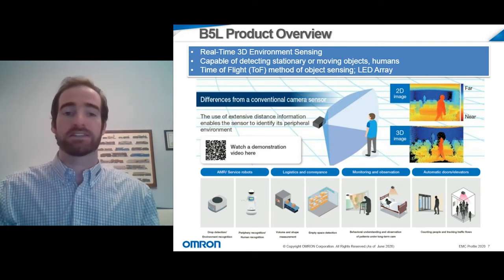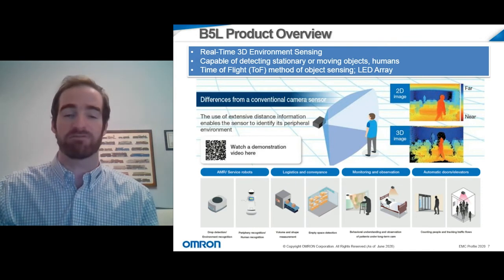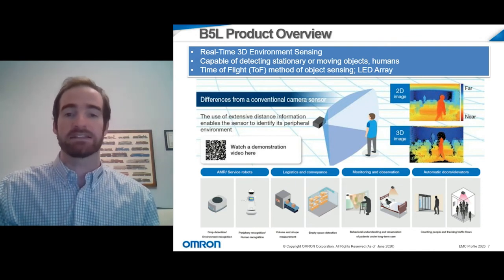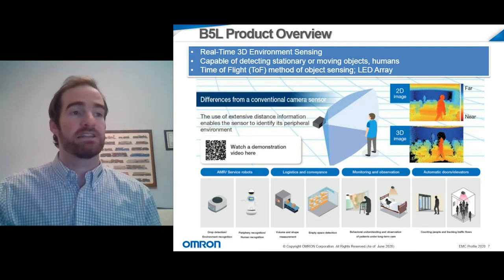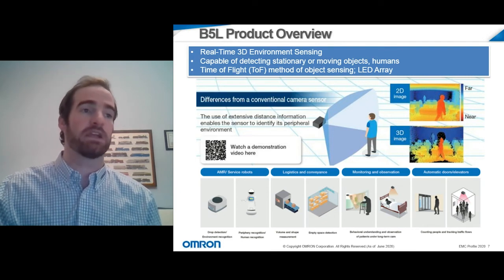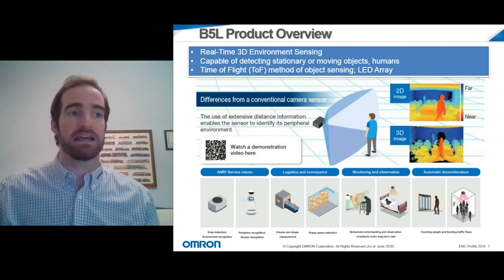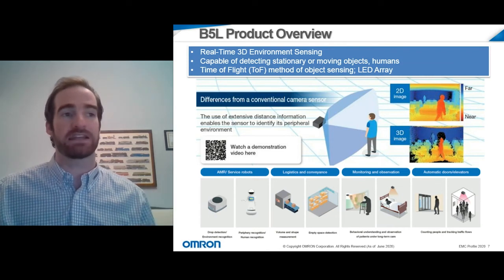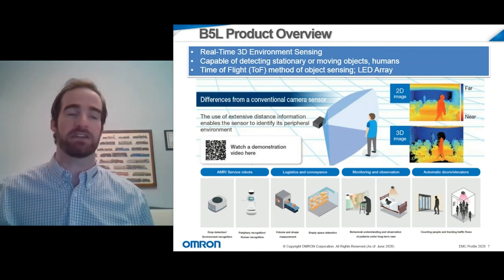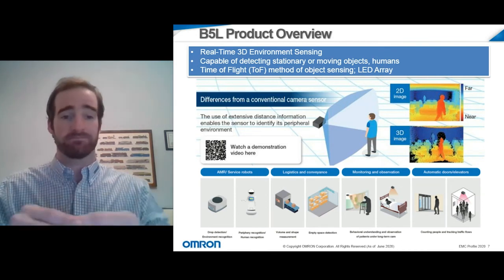The sensor utilizes a 3x4 LED array that we mentioned in the previous slide to work as effectively as possible. And using the data collected by the LED signals, the sensor is not only able to read the data projected into a 2D space, but if you see the 3D image on the right-hand side of the screen, while it's not a full video of the 3D space that you're looking at, it does give a representation of how the sensor is able to collect this data and construct a space that you're able to monitor and look at the people as they move around an office space.